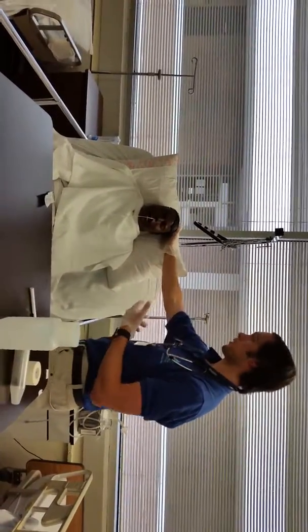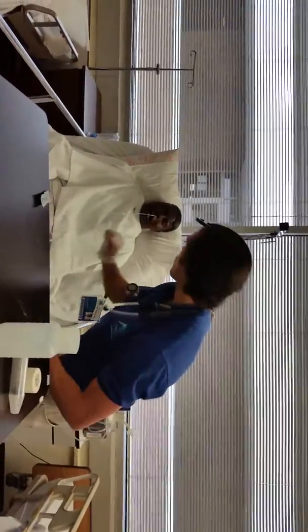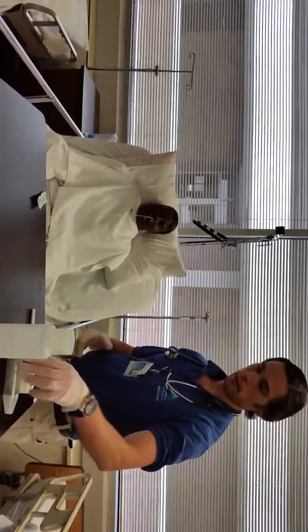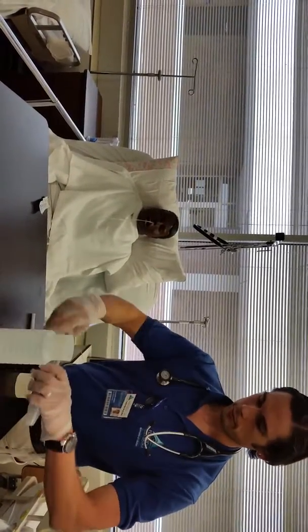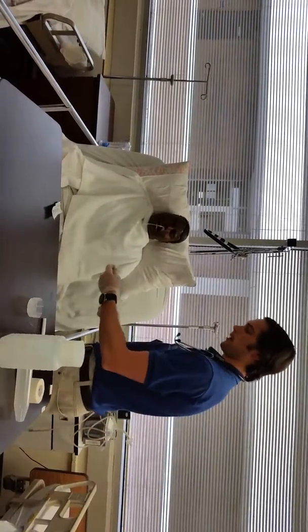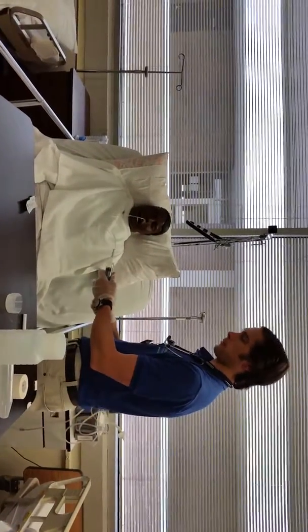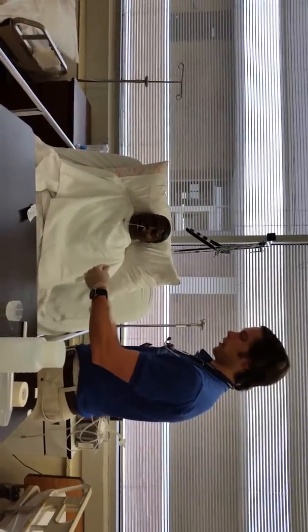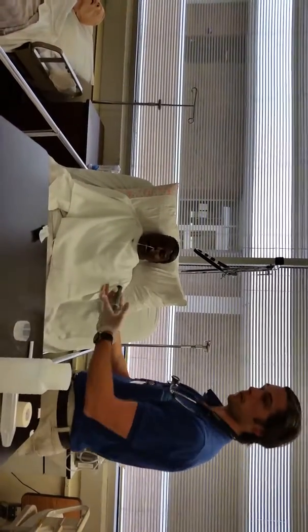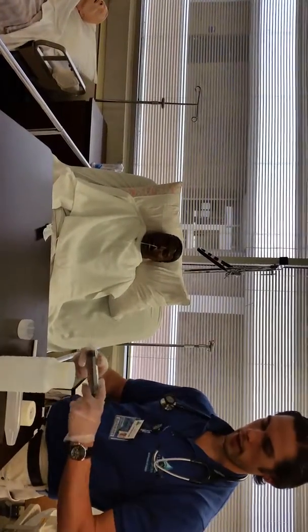I'm going to check placement by having the patient talk to me. I check again and see if it's coiled at all in the back of the throat. And then I would aspirate and check the consistency of the content. And then, according to the protocol of my hospital, I would check the pH for the record, confirming placement of the NG tube. So we've done that.